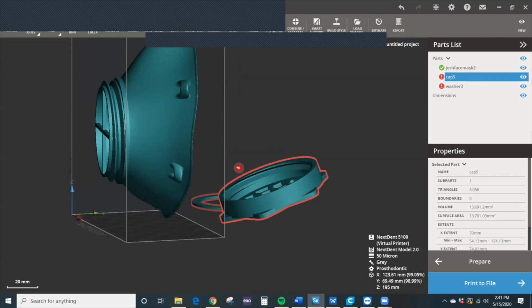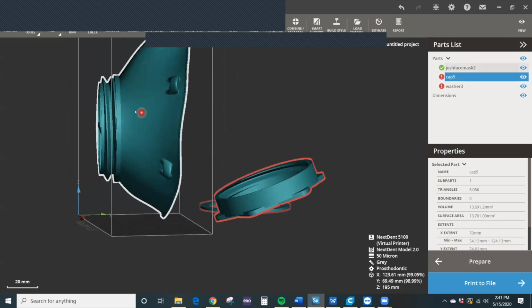Now, you want to do your due diligence if you have sprues on the threads itself, where you trim off and contour it up as best as possible. But again, if there's a little bit of material left behind, you still will be able to utilize your cap and twist it on properly with a good seal at the end of the day.